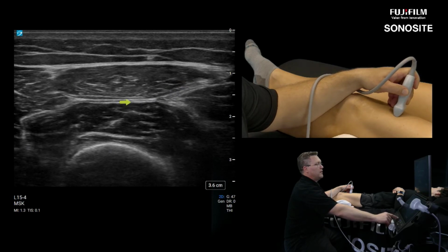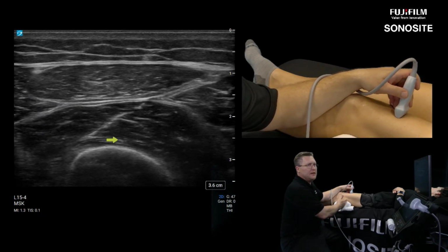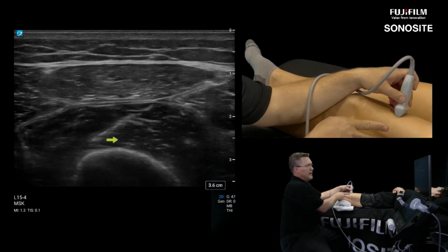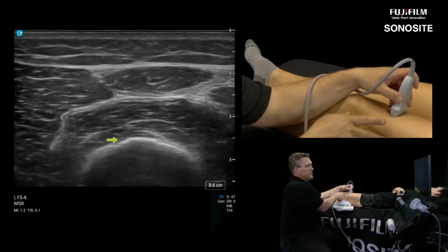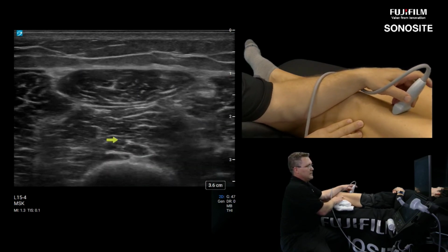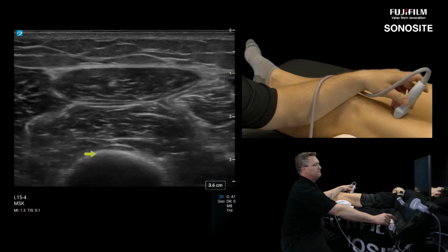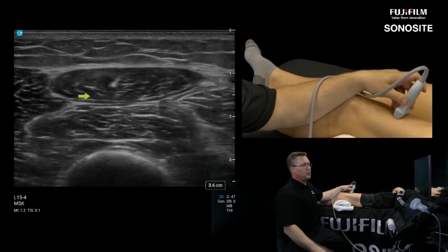If you're evaluating for atrophy, I will say don't go off of one slice when you're comparing this muscle to its surroundings. They run at slightly different angles, okay? So if I'm cutting the rectus femoris in short axis perfectly perpendicular, that means your vastus intermedius is at a slightly different angle, unless you're really compressing the two together. So you have to tilt, and you'll get the distal, deeper vastus intermedius to highlight really nicely over the femur, but not all the time will you get the rectus femoris to highlight really nicely there. So it's one or the other.